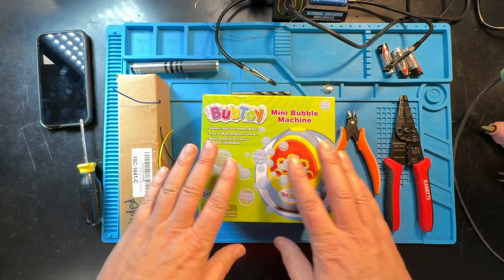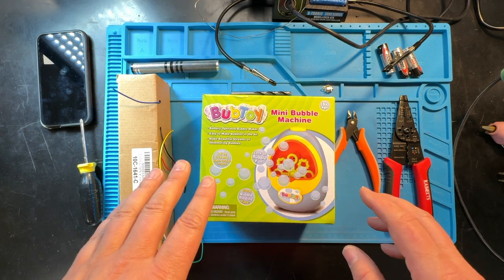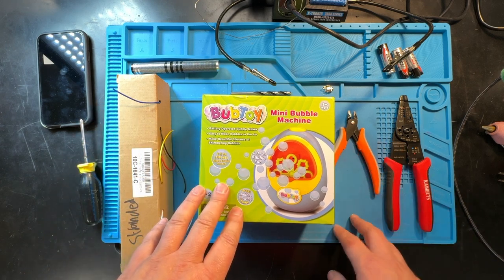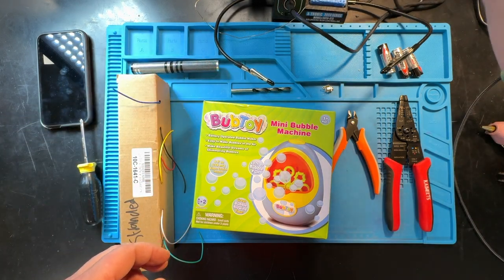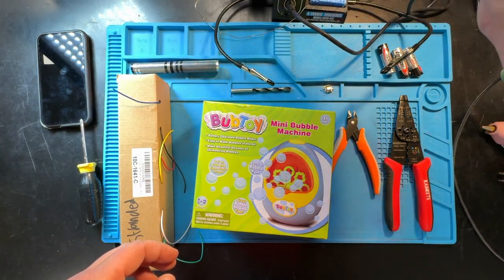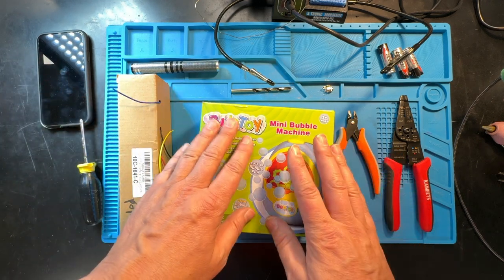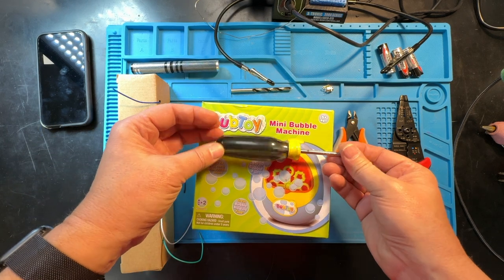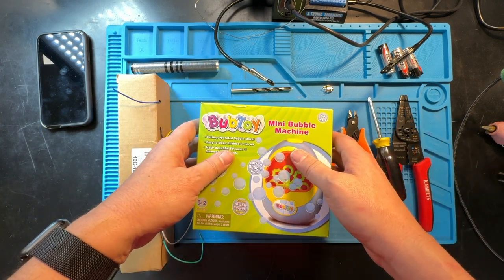We are going to switch adapt this bubble machine. We've got a handful of basic tools: wire cutters, wire strippers, a drill with a quarter inch drill bit, and a soldering iron. We also need a screwdriver — there is one that comes in the box, but one with a slightly larger handle works better. You can always get by with the one in the box. So let's get started.